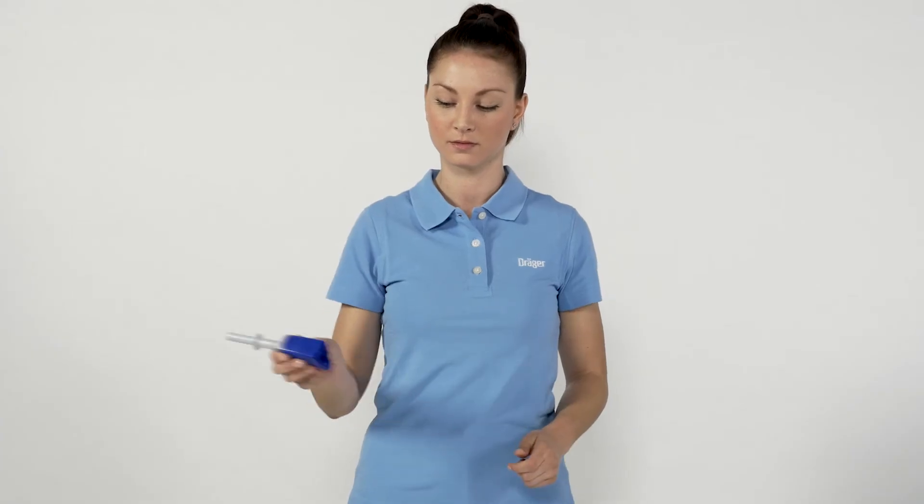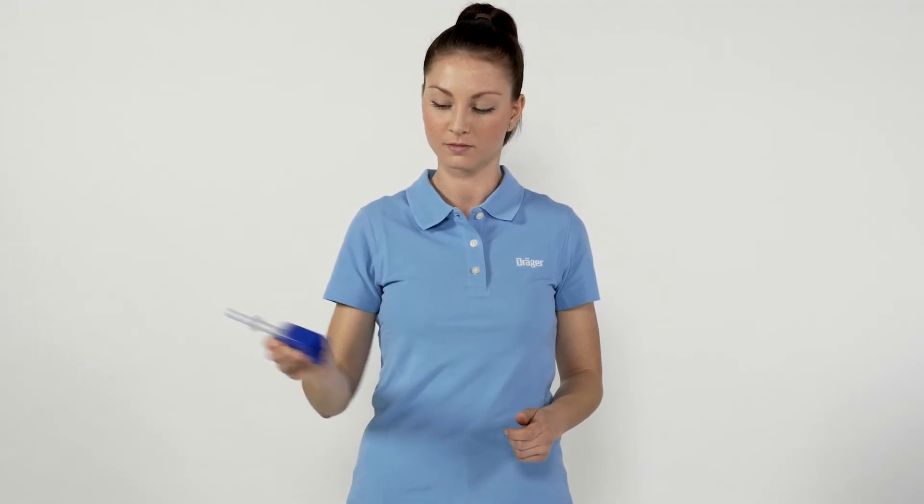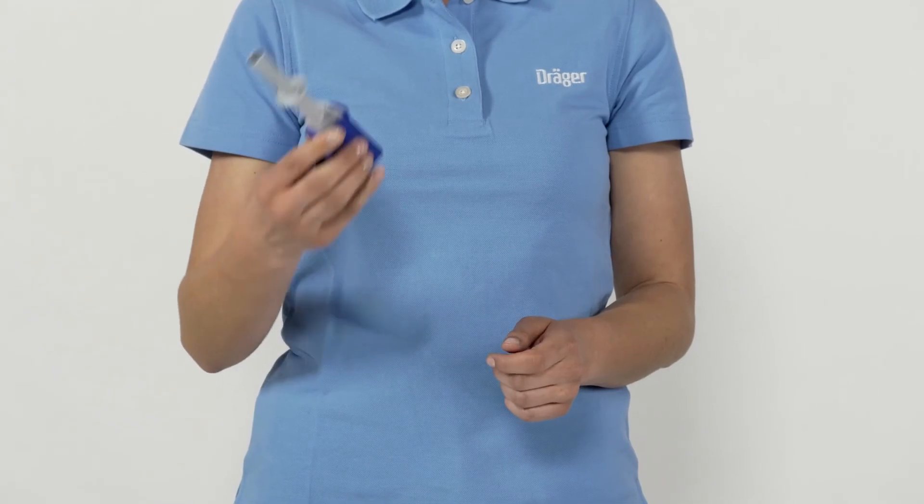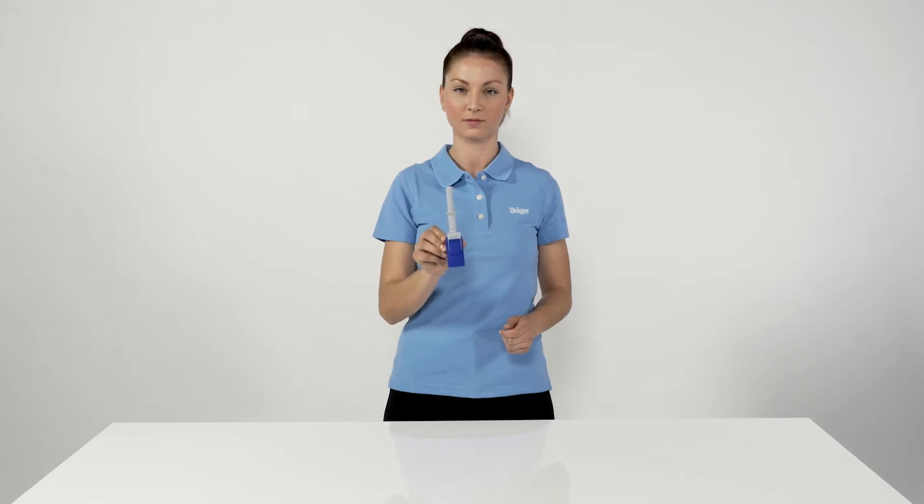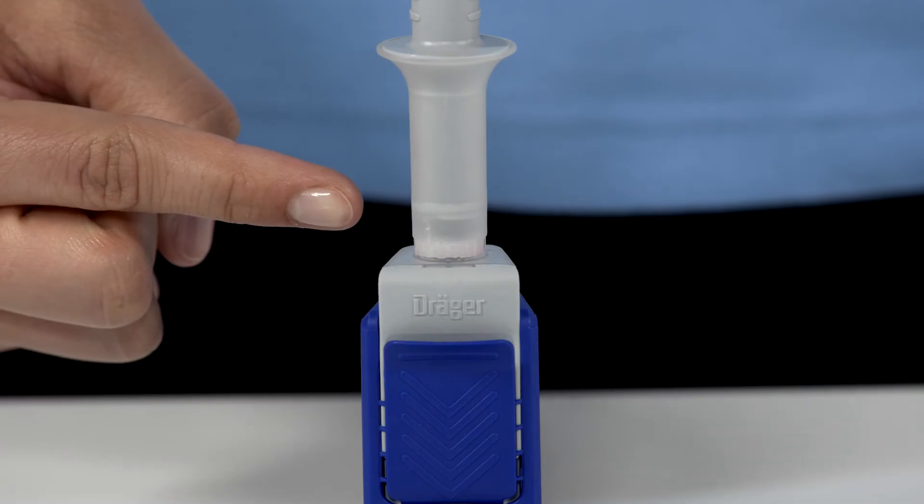Shake the test kit until the red indicator ring has completely discolored. Hold the test kit upright or stand it on an even surface. As you see, the red indicator ring has discolored.